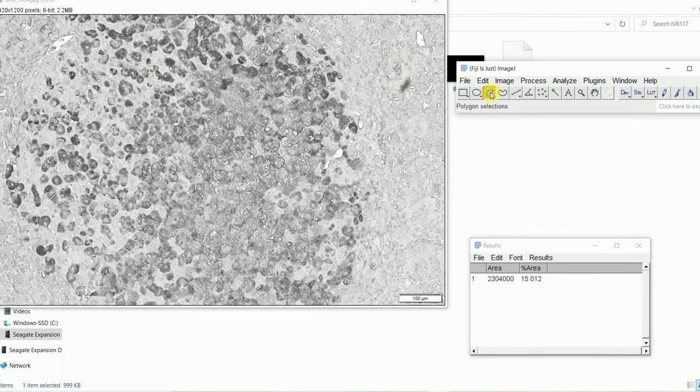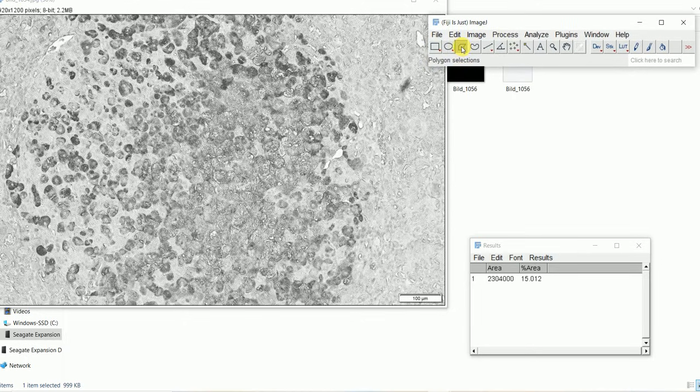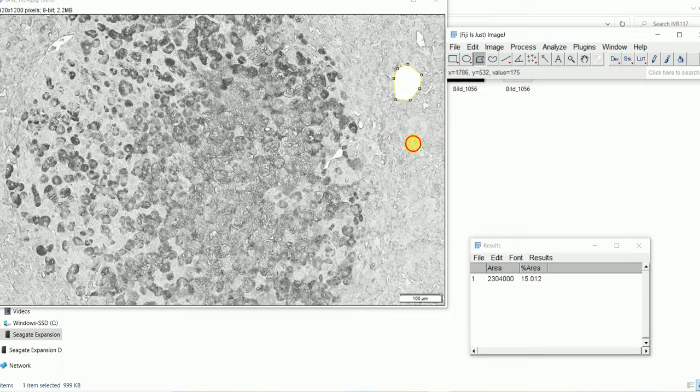To get rid of that, I will click here. You need to click on this icon in ImageJ. I hope you can see everything clearly. So click on this icon in ImageJ, and then you just make a circle around it, and it has to become like this. Then you can go to edit and cut it. Okay, you cut it, and so you got rid of this black part, but this will not change the total area of the image. It will remain the same.